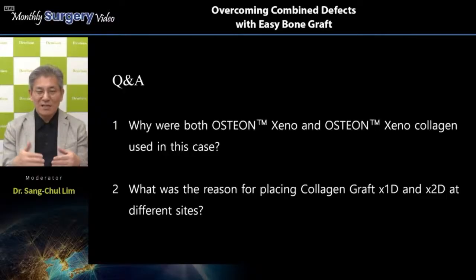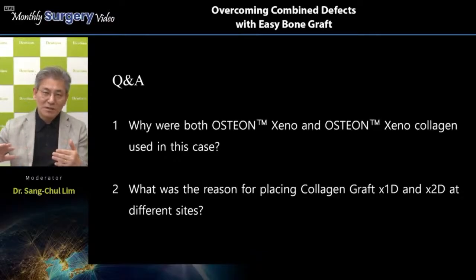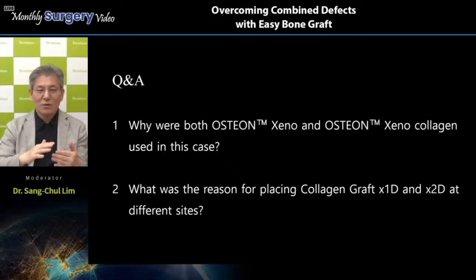And X2D is stiffer due to the collagen density, right? As I mentioned before, the big difference between X1D and X2D is the collagen density, right? So X2D is used for the tunnel technique, or some root coverage, or damming on the labial side and the buccal side, right? So in this case, Dr. Chung is going to use X2D for the labial side damming, and X1D for covering the top portion of the exposed area, right? So when we have suturing, X1D is better.